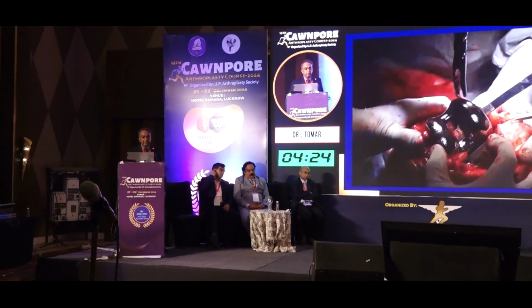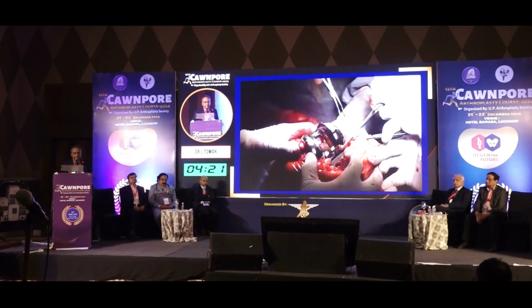So this is a video presentation. In the usual manner, with tourniquet or without tourniquet, a midline incision with medial parapatellar approach, and we can give a small quadriceps snip proximally in the quadriceps for better eversion of the patella and to protect the patellar tendon. We collect the samples from the suprapatellar region and remove the entire infected synovium, take the samples, then come to the medial part of the proximal tibia. There is a periosteal elevation till posteriorly, remove the tibial insert, and make the exposure easier.